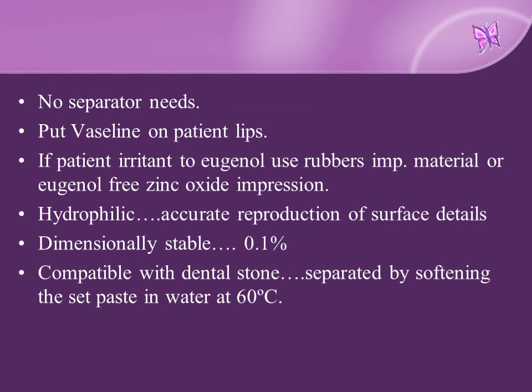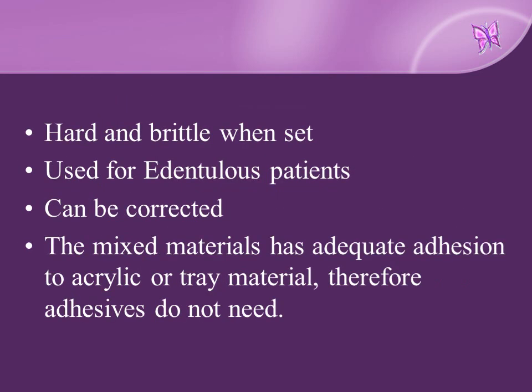Hydrophilic, accurate reproduction of surface details, dimensionally stable, compatible with dental stone, separated by softening the set paste in water at 60 degrees. Hard and brittle when set, used for edentulous patients, can be corrected. The mixed material has adequate adhesion to acrylic or tray material, therefore adhesive is not needed.